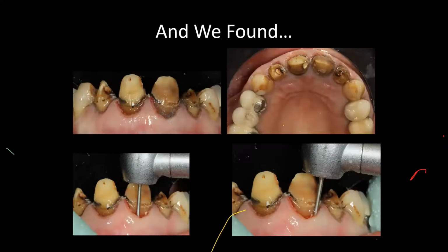It's not a final margin. This is not a definite margin. We're going to make temporaries. We've got things to do. We got to do implants. We got to plan the implants posteriorly. We got a lot of other things to do. But at the same time, we're getting a smile line set up, getting all the other parameters set up. Is everyone on the same wavelength as me up to this stage? If you're not, please tell me so I can explain.